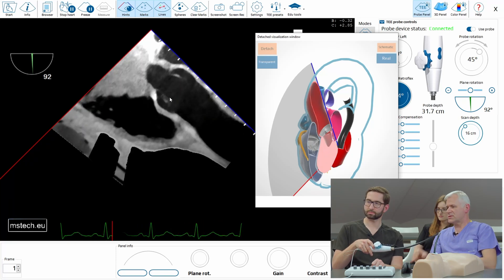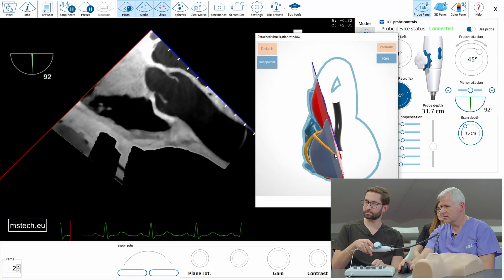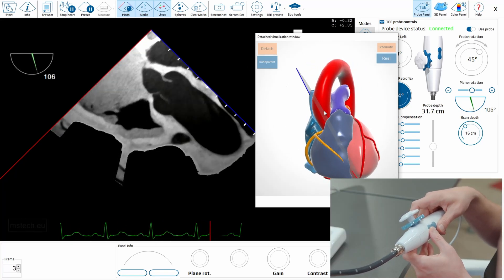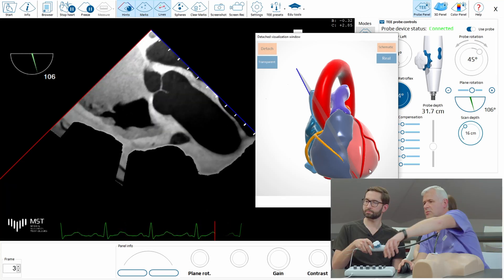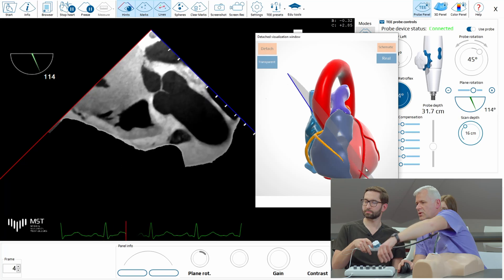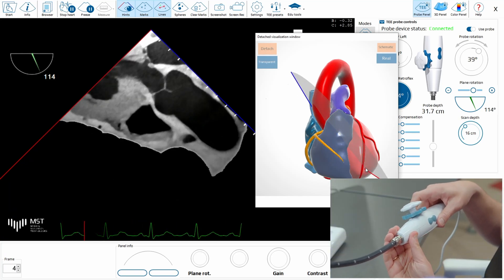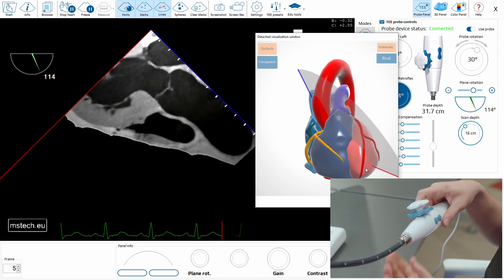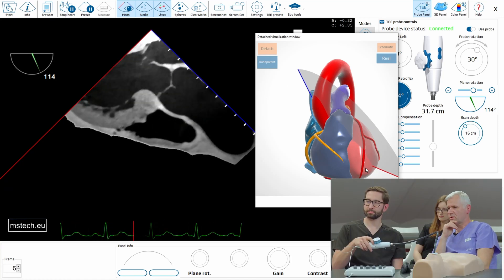Of course you have to slightly correct the angle to really have it coaxial. Yes, perfect. And you have it coaxial — I would even correct it slightly more and rotate it like this. And now you can see it's really a long axis view. So this is the transgastric long axis view.